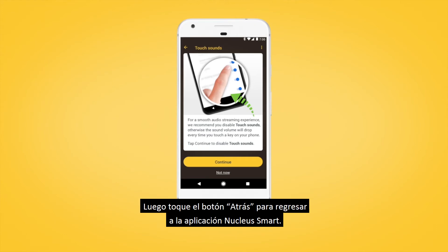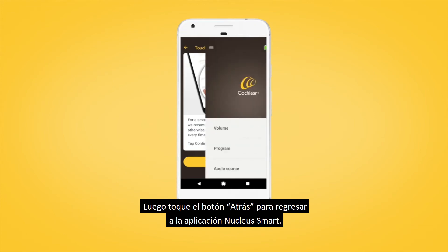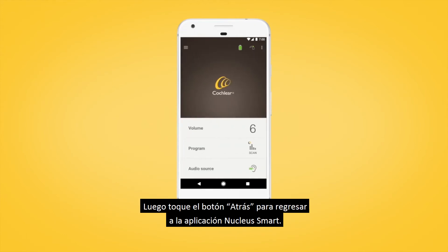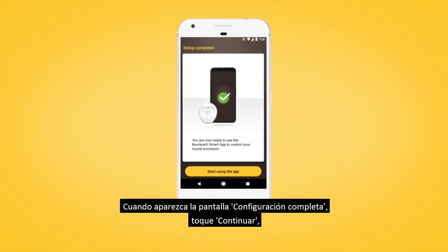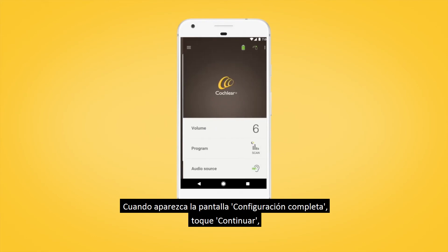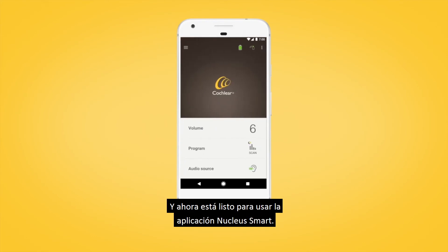Then tap the back button to return to the Nucleus smart app. When the setup complete screen displays, tap Continue and you're now ready to use the Nucleus smart app.